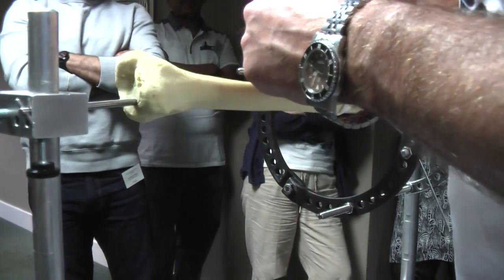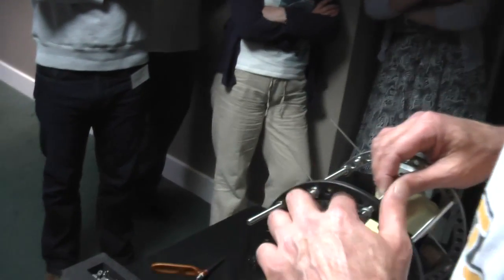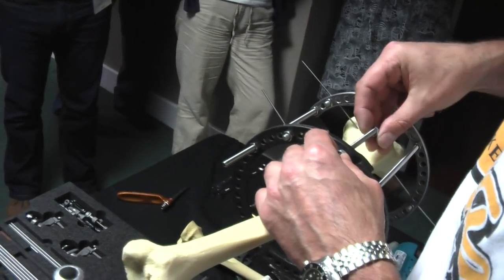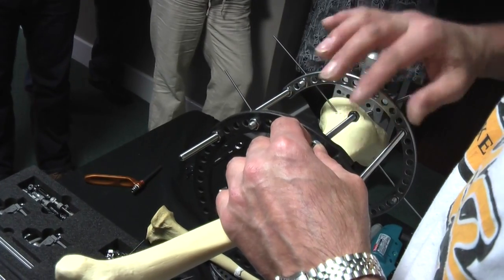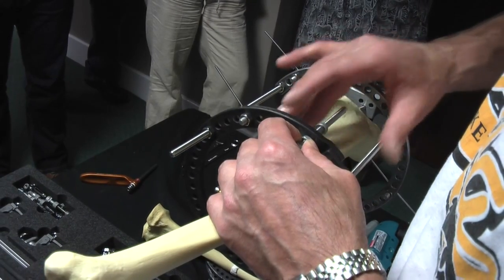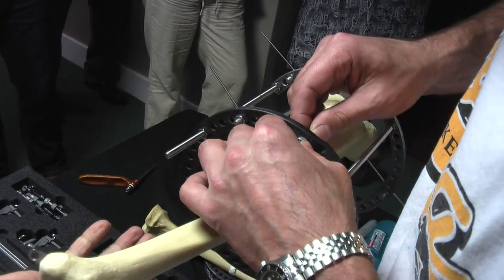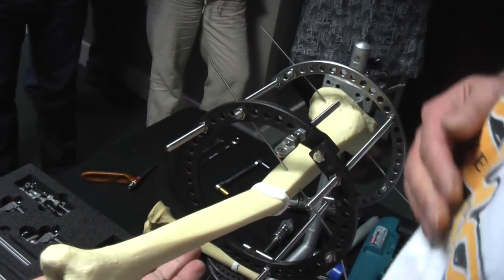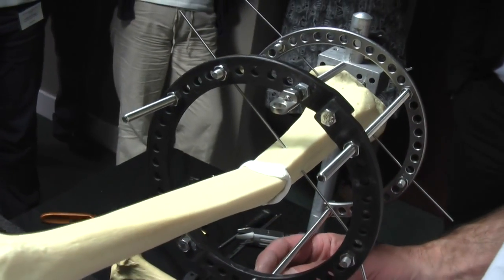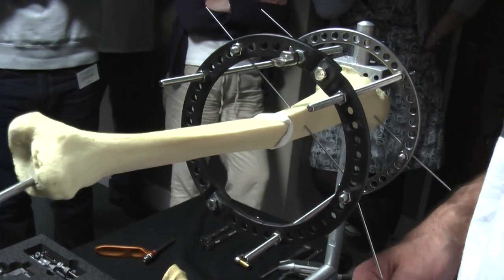So we're going to put one hinge about there, like so. There, so it sits right on that border, right on the convex border, and the other one's going to go exactly around the other side.